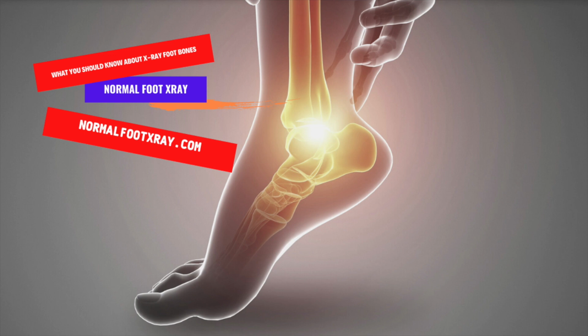A surgeon can better visualize a fracture by using an oblique X-ray in a patient. An oblique X-ray of the foot is important for determining whether a bone is broken or fractured. The lateral tarsals, calcaneum, and navicular bone should be examined. Oblique X-rays are useful for evaluating the foot.